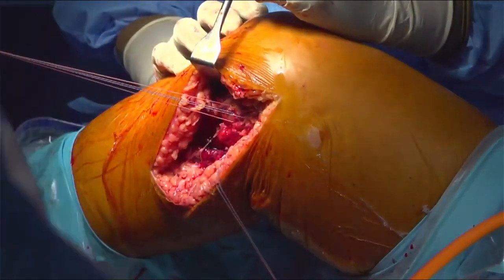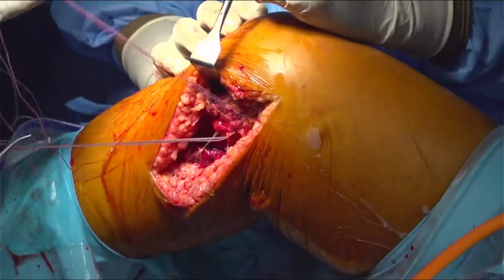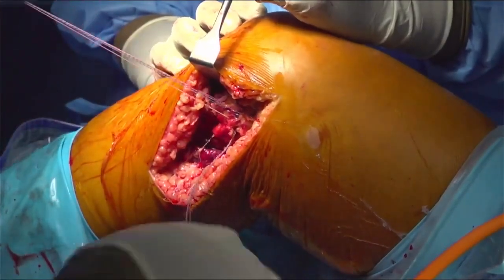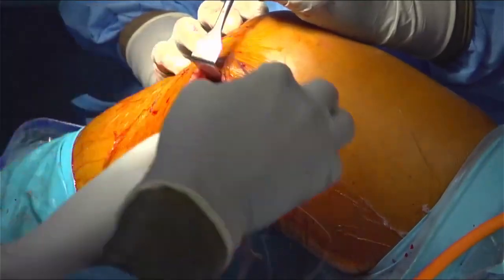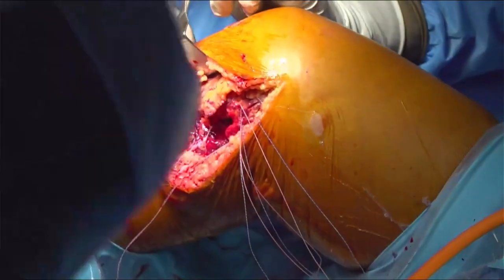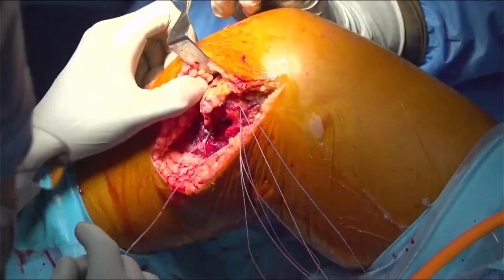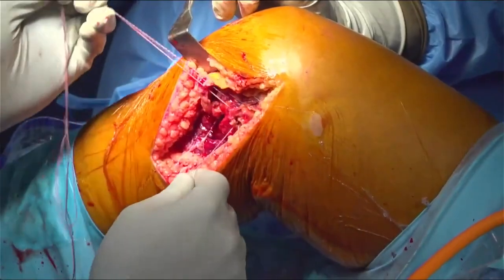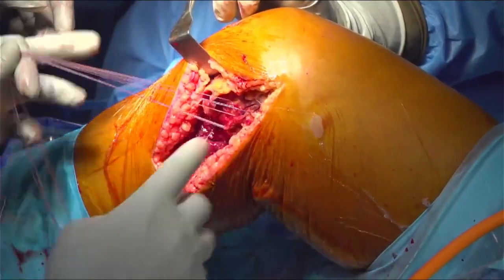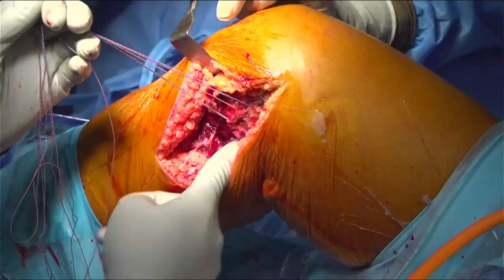Now we have seen that we have passed all the four sutures here and here into their place. So we have passed these four sutures and these four sutures into their place.